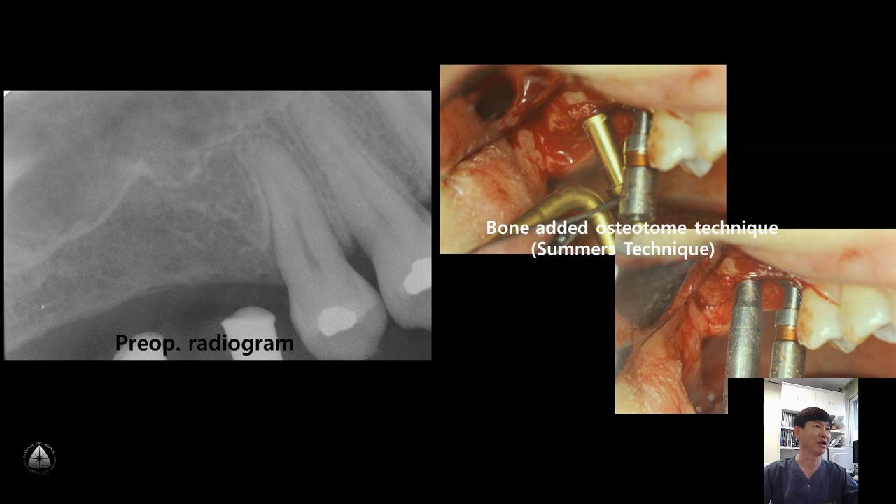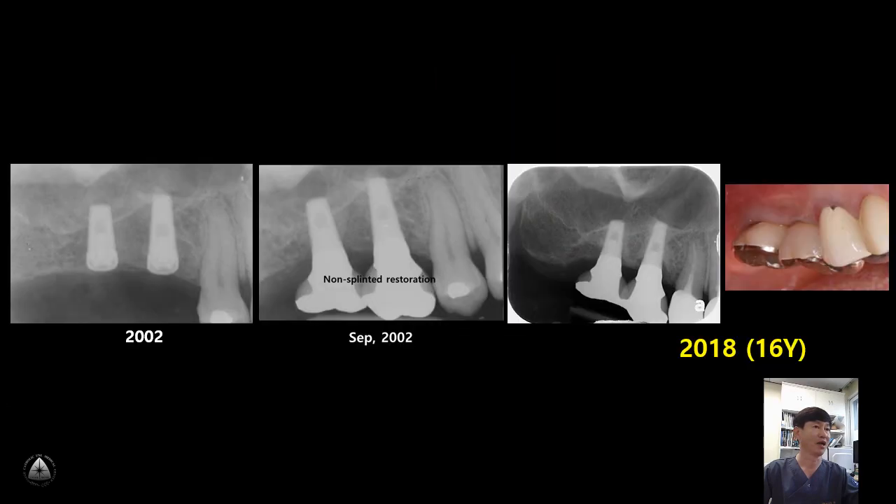This is one of my early cases using the osteotome technique. This slide shows 5-6 mm residual bone height on the right posterior maxilla, so bone-added osteotome technique was performed. This is a 16-year follow-up — very stable marginal bone is seen after 16 years of loading. This is a very minimally invasive technique compared to the conventional lateral approach.